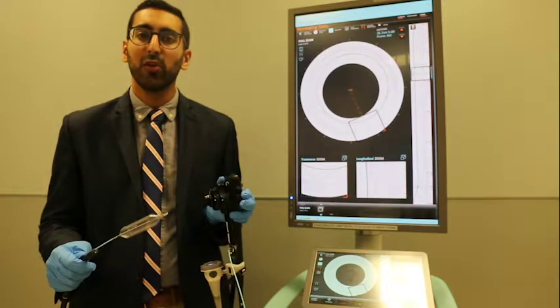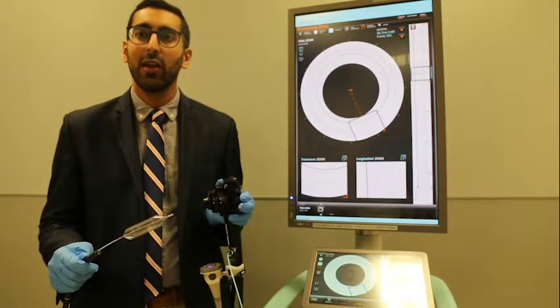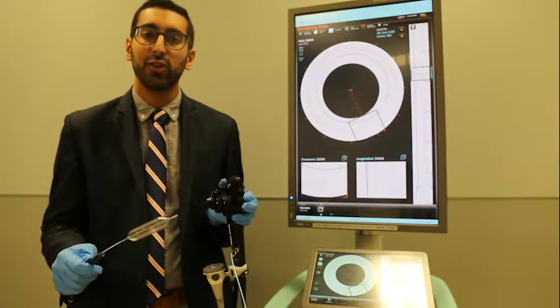VLE imaging can be performed as an automatic or manual scan. If a region of interest is observed, this can be marked with 1 or 2 superficial laser marks for targeted biopsies. We hypothesized that VLE could help with a more accurate estimation of lesion size.